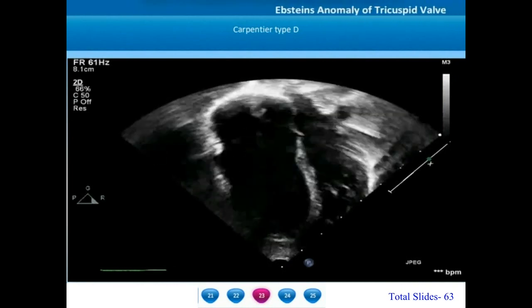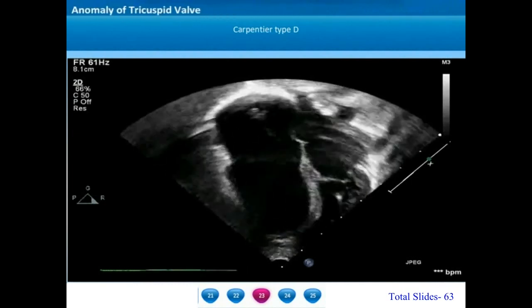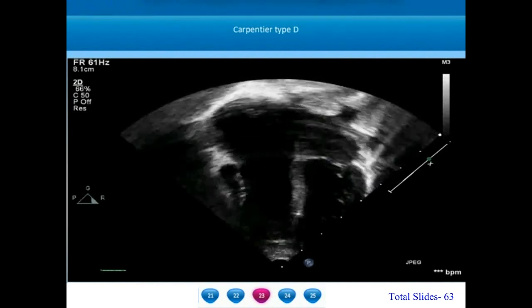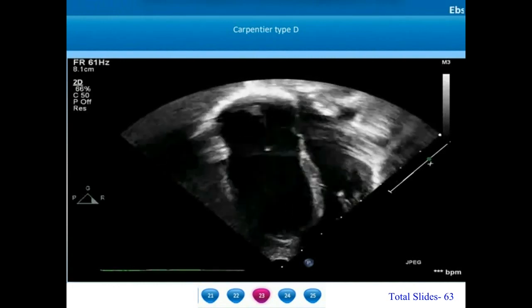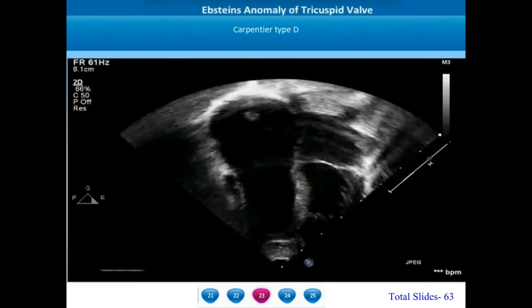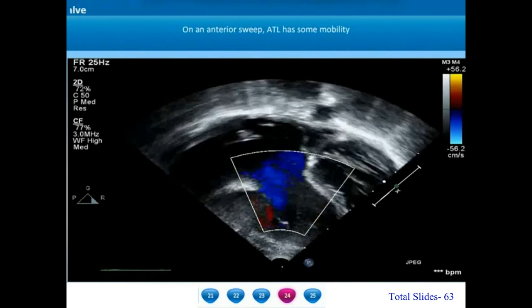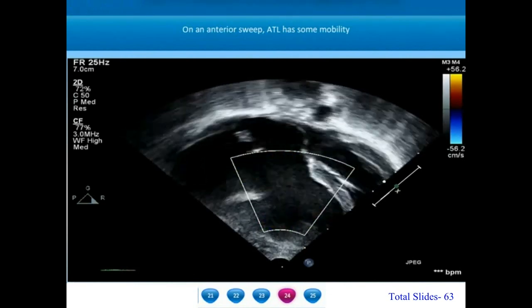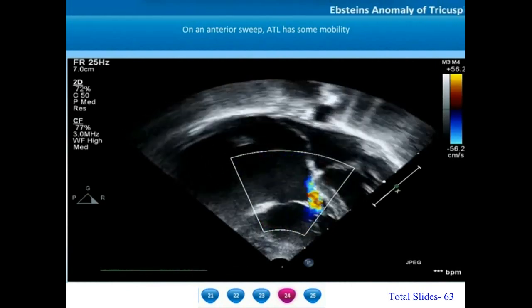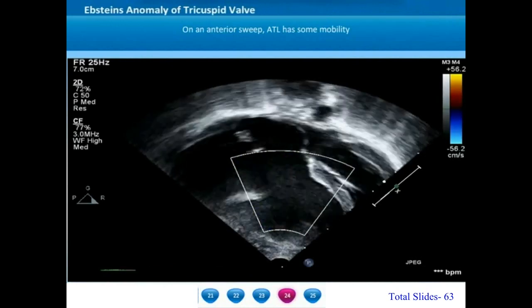Carpentier type D is the extreme form of Epstein's anomaly where there is complete failed delamination of all the leaflets. The whole of the anterior tricuspid leaflet is significantly tethered onto the right ventricular anterior free wall. There is marked dilatation of the right atrioventricular junction and the interventricular septum keeps bowing into the left ventricle in each diastole. When making an anterior sweep in the same patient, the most anterior portions of the ATL have some degree of mobility while the posterior portions are totally tethered. There is only very minimal tricuspid regurgitation even though the abnormality is more marked.